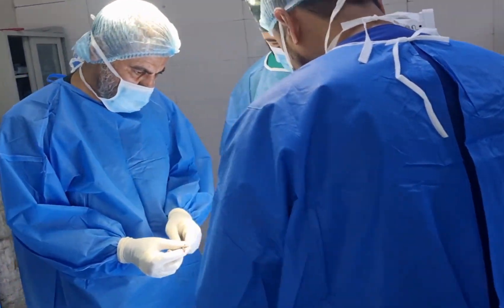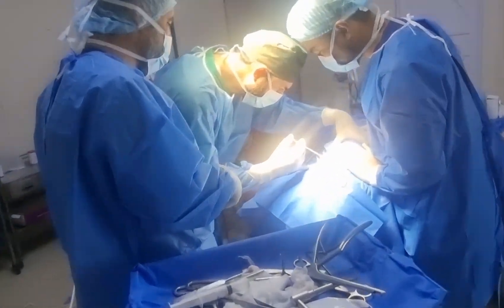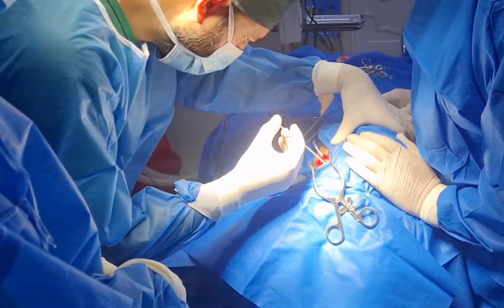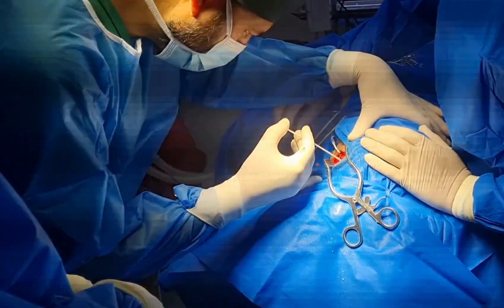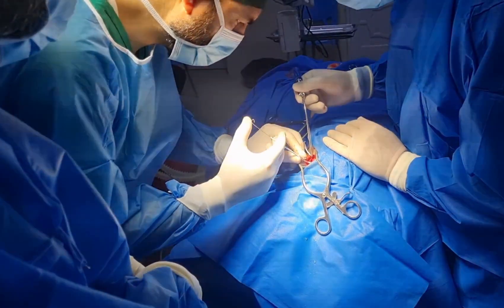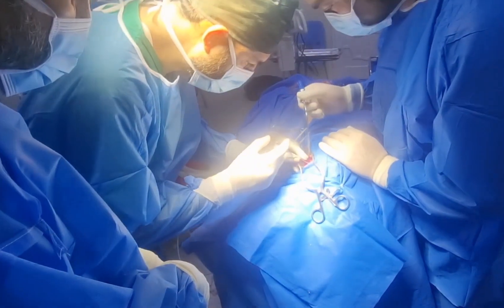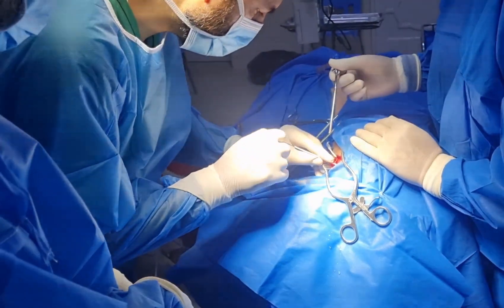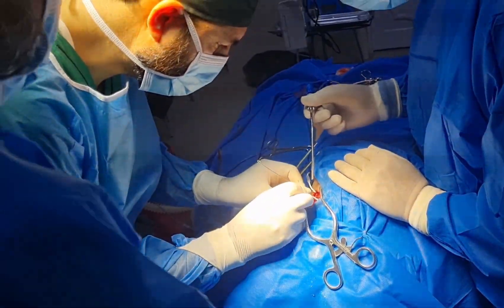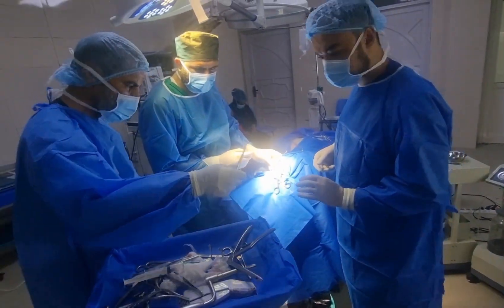This is during surgery. The surgeon inserts a drainage pipe into the ventricles. This is the drainage pipe being inserted into the ventricles. If CSF is coming through the pipe, the insertion is confirmed as correct. See how to insert the pipe into the ventricles — if CSF is coming, it is okay for the patient.